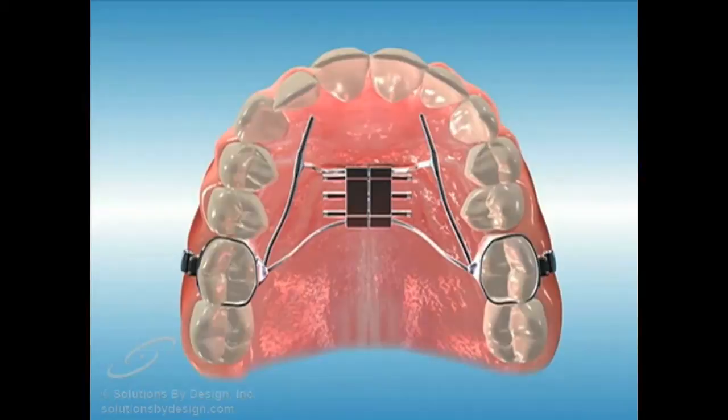An expander is for patients whose upper jaw is narrow. It gently widens the upper arch by stretching the center palatal connective suture. The expander is prescribed only prior to completion of growth.